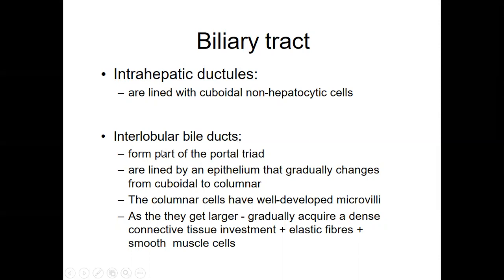Okay, the interlobular bile duct forms part of the portal triad. That is a component of the portal triad. The interlobular bile duct is the bile duct located between the lobules. It forms part of the portal triad.